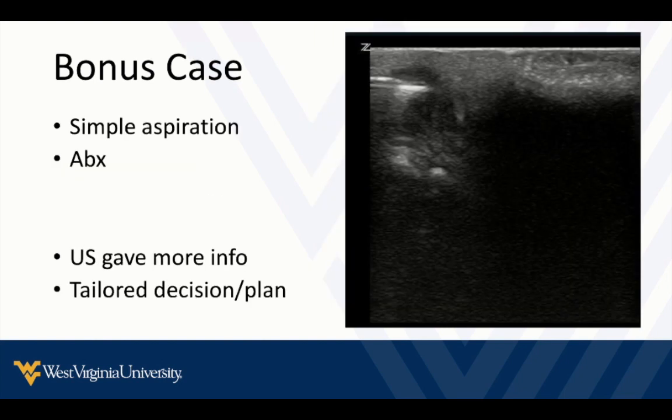This is a good candidate for just a simple aspiration, so probably a more painless and easier procedure for the patient, probably easier for you as the provider as well. Give them antibiotics after you do a simple aspiration on it, and this patient did well. What I want to point out here is that by using ultrasound, we saw, one, there's a lesion here that I probably didn't even suspect on exam, where I didn't see anything on their skin, so it helped us make that diagnosis. But also we see it's pretty small, pretty round and well circumscribed, pretty accessible to a simple aspiration, and I don't have to do a bigger incision and drainage, which makes your life easier, makes the patient's life easier and less painful, and helps us give a more tailored care plan to this patient.